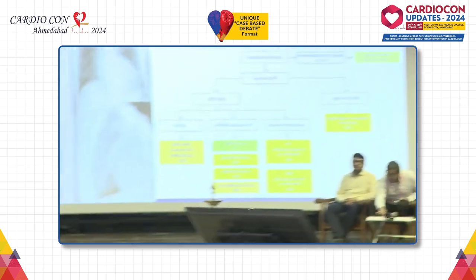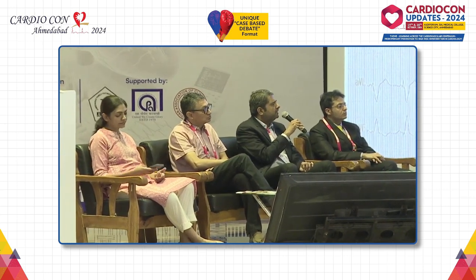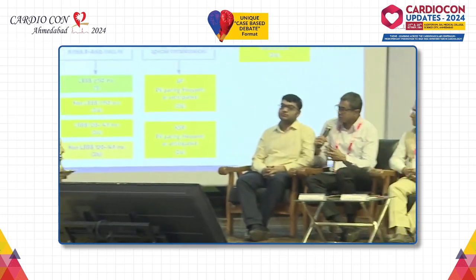Sorry, one last question to Dr. Samir. Would you consider in any way going to measure the HV interval, and simultaneously try to modify the substrate of the scar location and optimize the antiarrhythmics, if at all just wanting to prevent an ICD lead, maybe a CRT-D? I mean, not prevent putting in a device, but go for the substrate mapping. And if in future he would require pacing, I would go ahead with pacing.